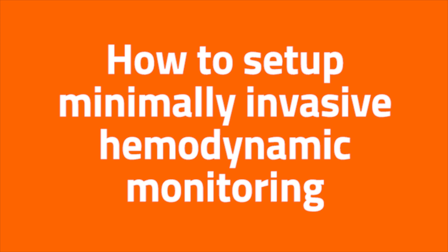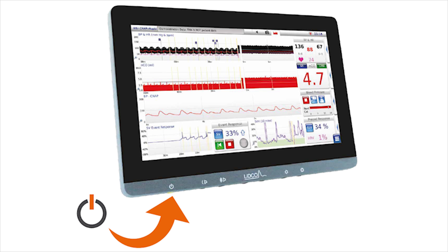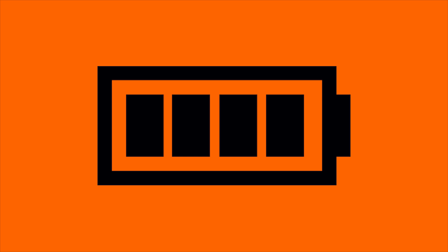Hi there. In this short video, I will take you through how to set up minimally invasive hemodynamic monitoring. Step 1: Power on the Litco monitor. Connect the power supply and power on using the button underneath the monitor. When AC power is not available, the monitor's battery can offer three hours of operation when fully charged.